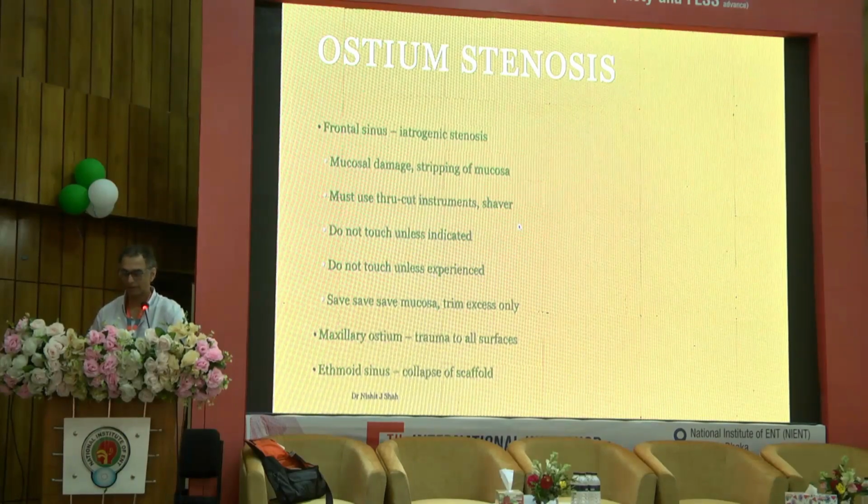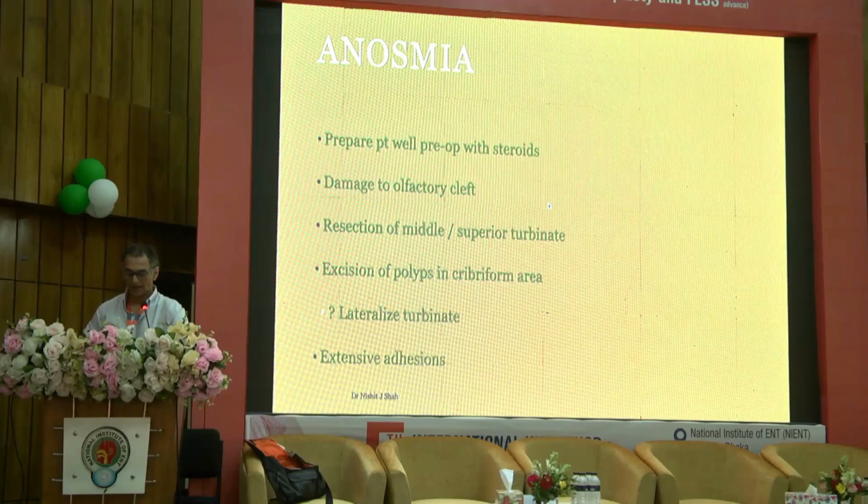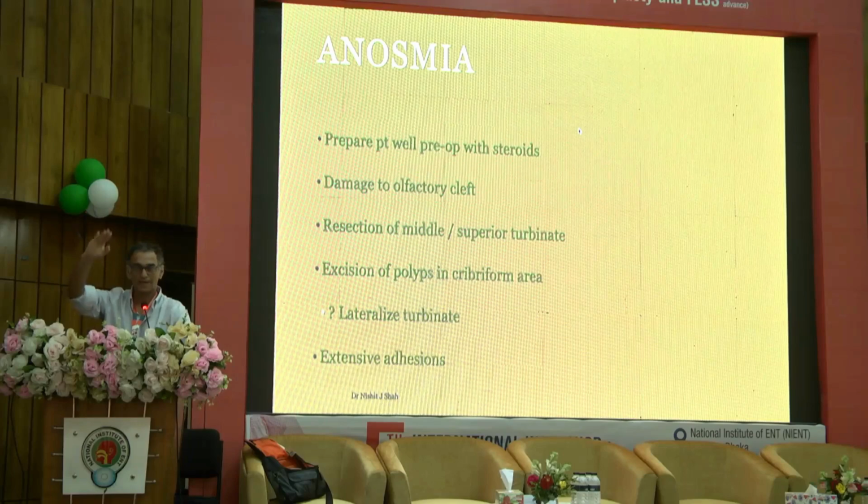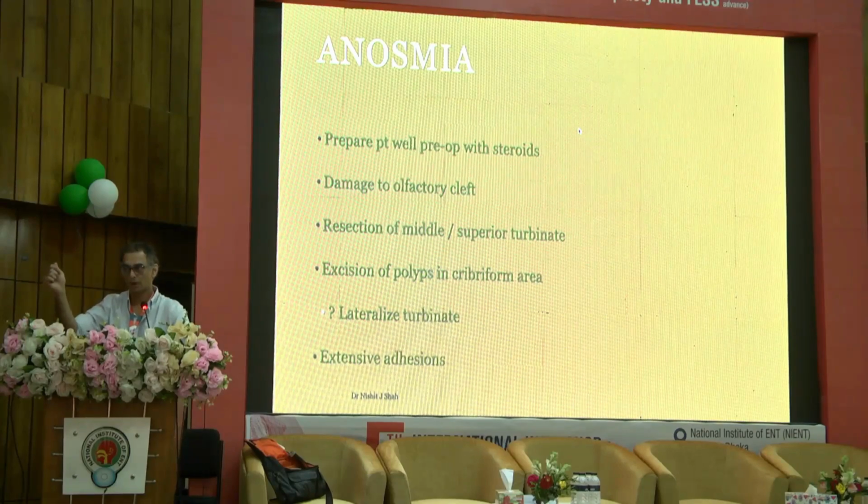Anosmia, if you've got polyposis patients, my limit is the inferior half of the superior and the middle turbinates. I will not go into the superior half because that's where your olfaction is. If you try and take polyps from that area, you will also permanently damage olfaction. So you stay in the inferior half and then you have to hope that medical treatment, since you've debulked everything else, is enough to clear those polyps.